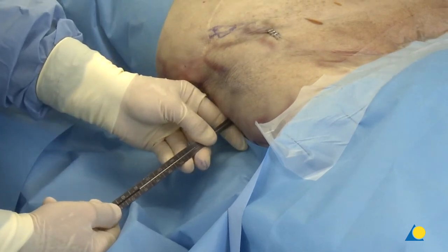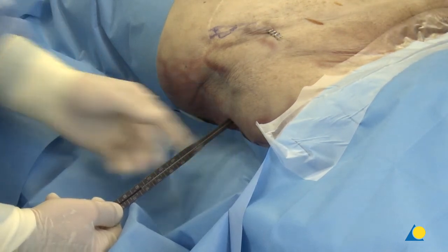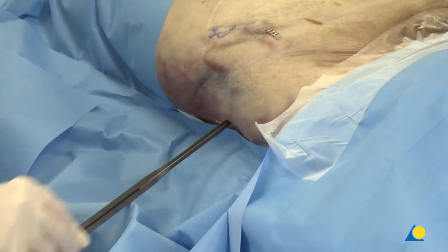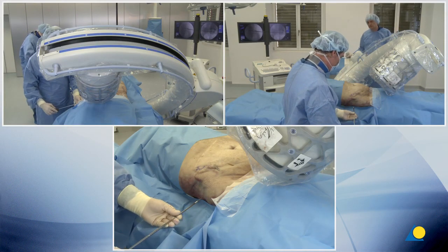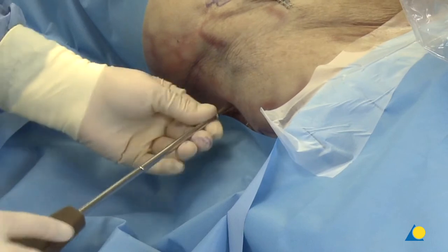Once the guide wire is correctly positioned, the screw length is determined and the screw is inserted. The screws are usually self-drilling screws, so unless the bone is extremely strong, the screw may be inserted without pre-drilling, which gives a better purchase.